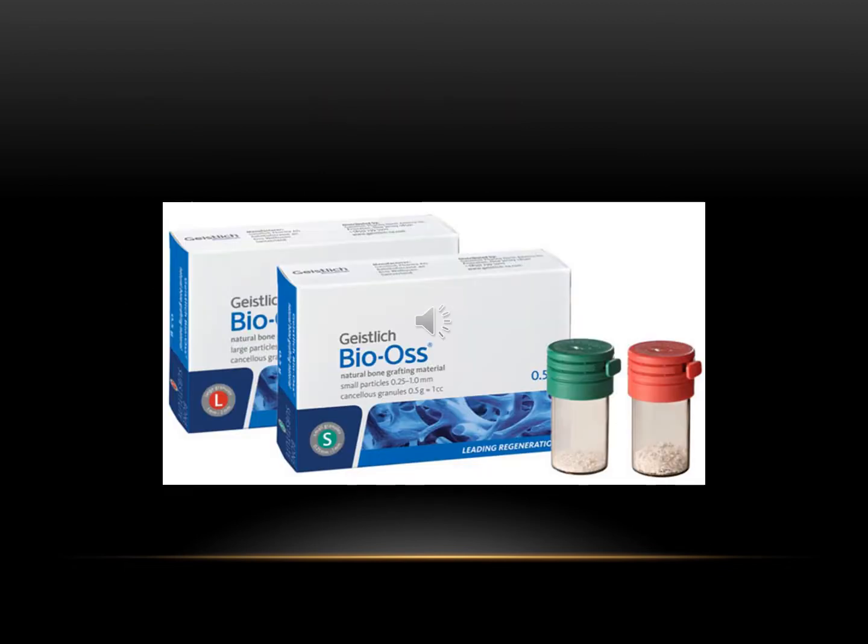This picture shows boxes of BioOss bone graft. Here it's powder bone graft in the picture, but there is in the market another type of BioOss in the shape of bone blocks.